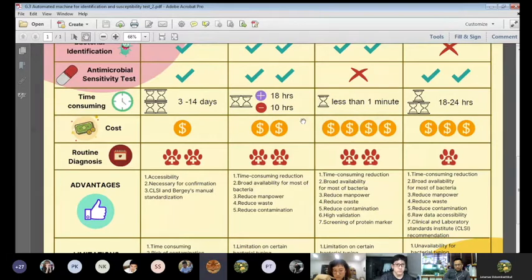We think that for better diagnostic tools, it needs to be less time consuming, the result should be reliable, and it is convenient to use. And it is a reasonable cost, not too expensive. These are the criteria we think it should have. Okay, good. Improved accuracy, right? And fast.